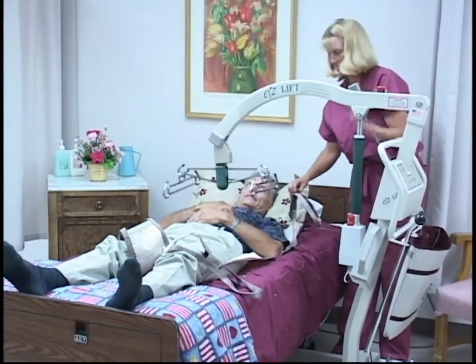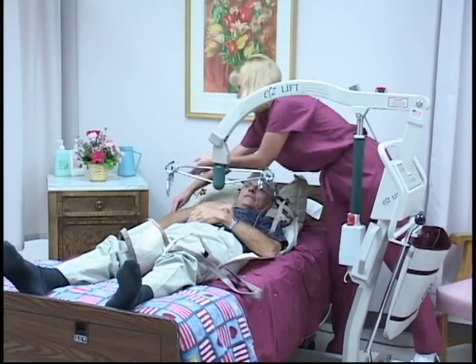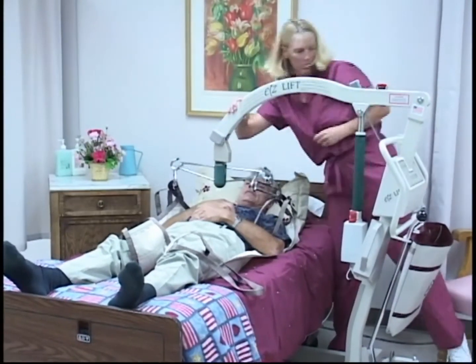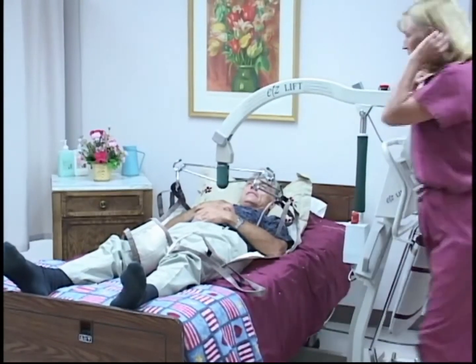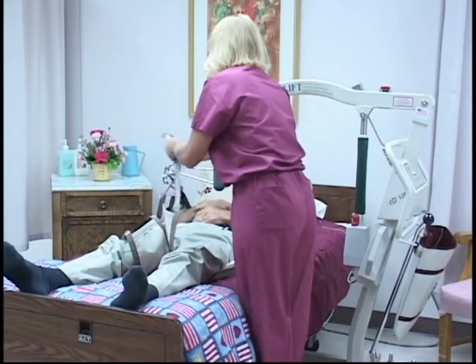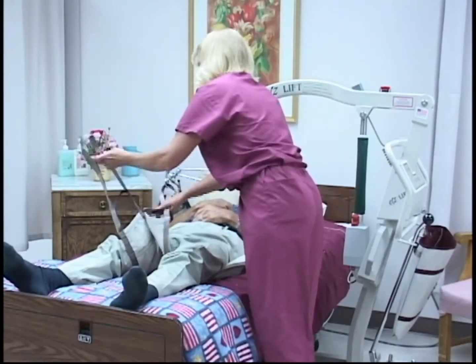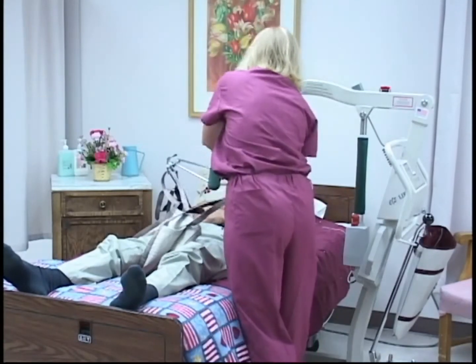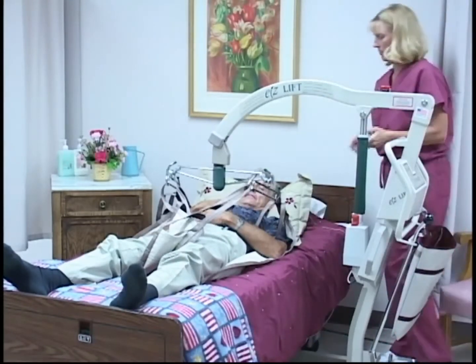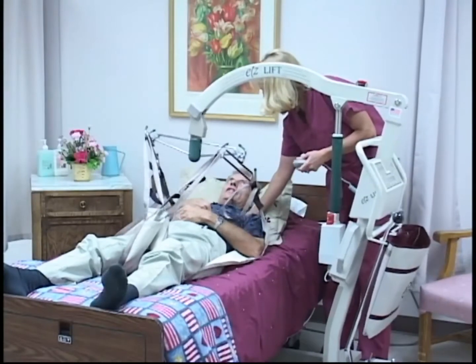Attach the straps by the patient's shoulders to the lift using the shortest strap. The hanger should be positioned as shown and be parallel to the patient's shoulders. Take the wing that is lying over the left leg and hook it on the right hook on the longest loop. Then take the wing lying over the right leg, cross it over, and hook it on the left hook on the longest loop. The patient is now ready to be lifted.